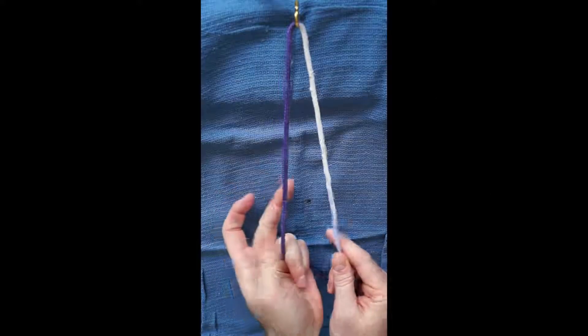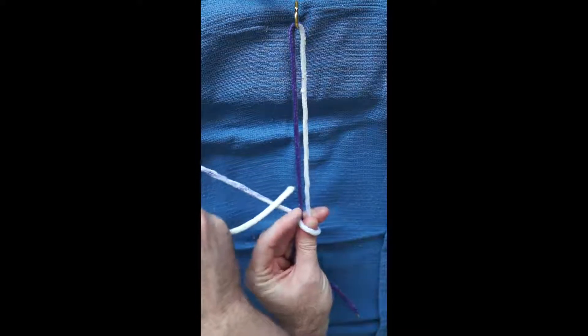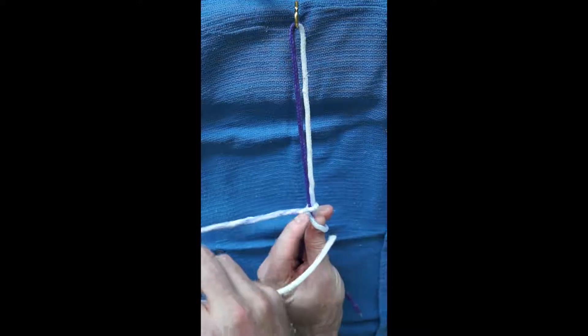Once the post is identified and shortened, both strands of the suture are pinched between the surgeon's thumb and middle finger on the post hand. The non-post strand is then draped over the thumb and passed around both strands.